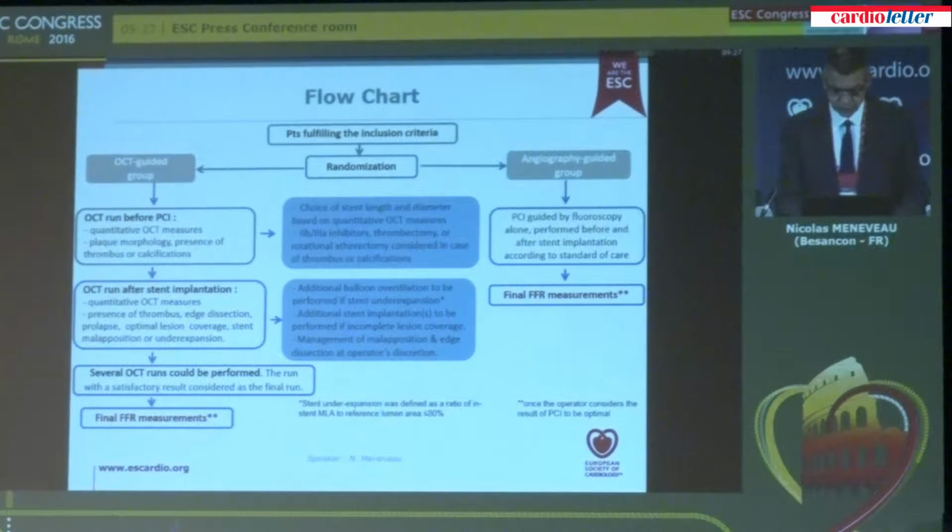This is the flow chart of the study. Patients were randomized in 2 groups. In the angiography-guided group, the angioplasty was guided by fluoroscopy alone according to standard of care. In the OCT-guided group, an OCT run was performed before and after stent implantation, and several OCT runs could be performed accordingly.